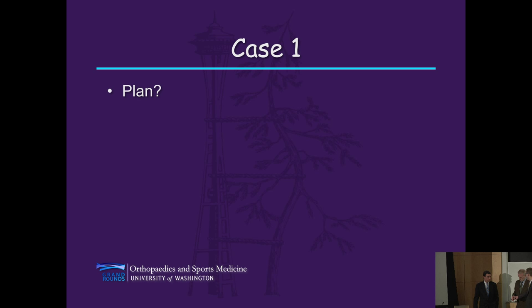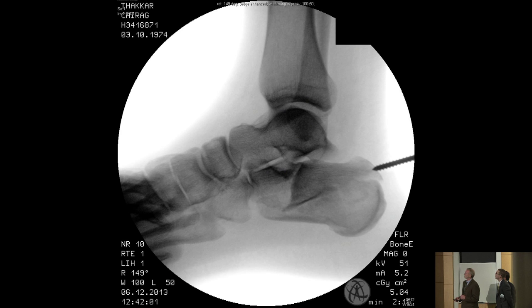This patient ended up in Dr. Sangeorzan's hands and got the minimally invasive technique. A Schanz pin was placed. An elevator is used to push upward on the front as the Schanz pin is used to rotate until this piece is down.